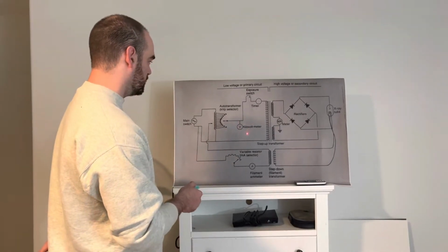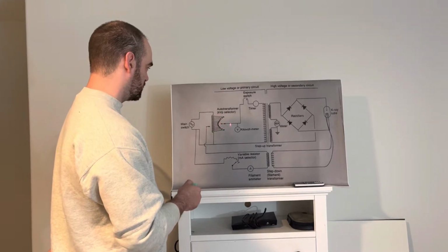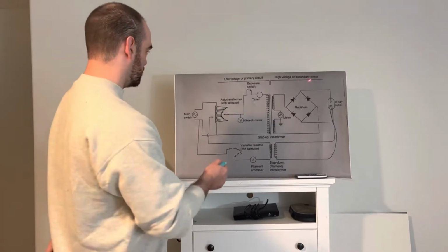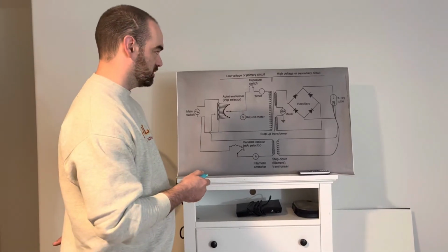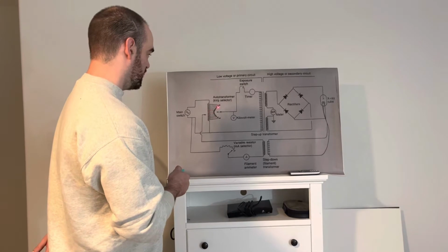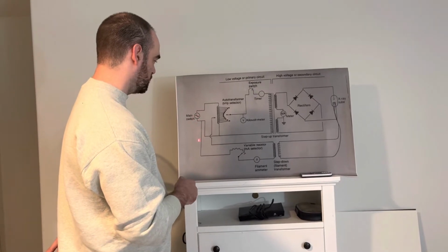The kilovolt meter will read that, and the arrow will go to the 120 setting, and we'll call that induction number 1 right here. There will be 5 points of induction within the whole circuit itself. Well, actually 6 points of induction, the 6th one being inside the X-ray tube. We'll get to that later. So induction number 1, and after that, we'll go to line number 3.